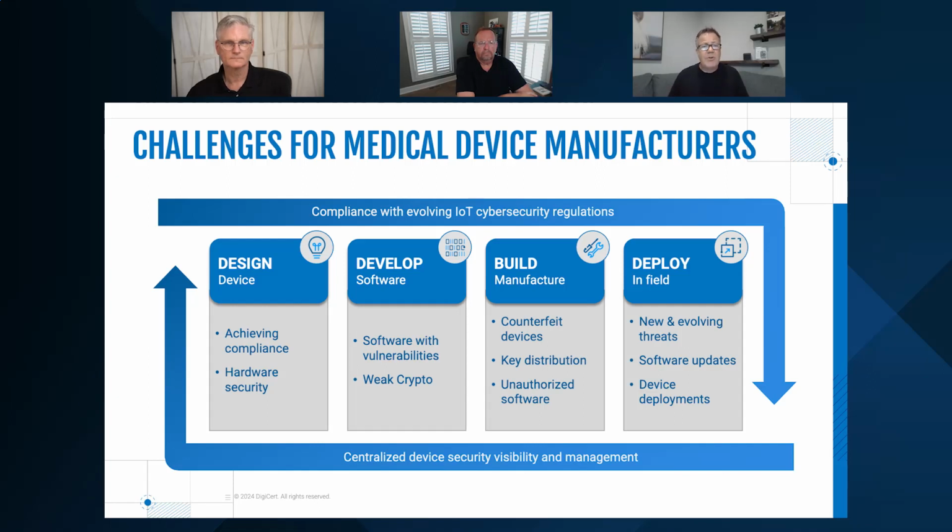Make sure that's secure. And then, that deploy phase is probably the longest phase, where the device may sit in the hospital or in an OR or clinic for 5, 10 years. These are expensive devices. And so, the medical device manufacturer is on the hook to monitor the device for exploits, vulnerabilities, new threats, do those updates in a timely manner.